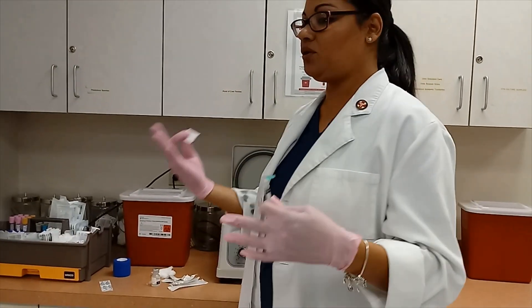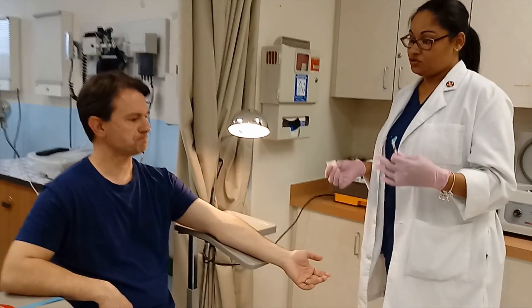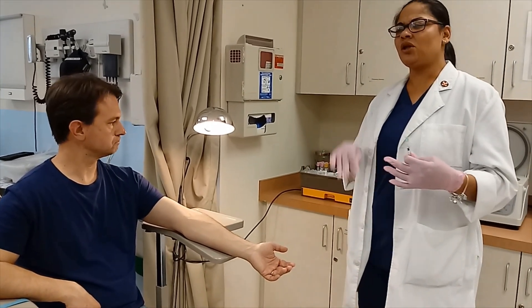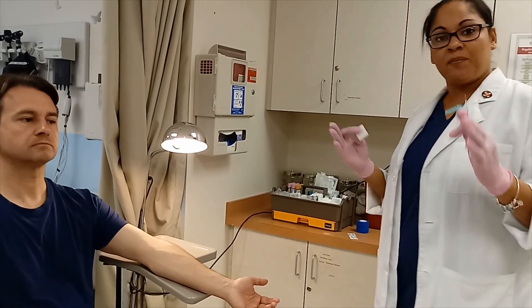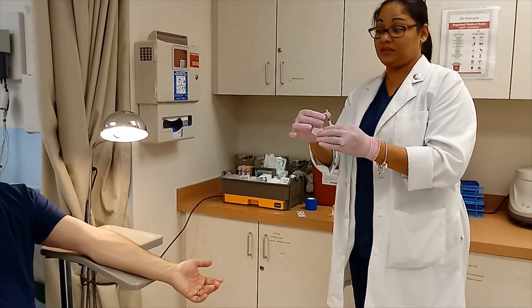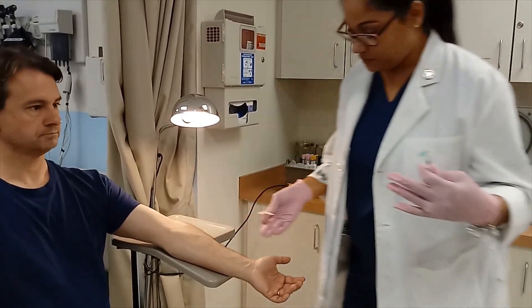We have our patient information and we know allergies. Have you ever had a TB skin test before? — Yes, approximately two years ago. We usually need to do this once a year for TB skin tests, especially people in healthcare. If it's been longer than a year, they do a two-step, meaning they come back a second time within two weeks of the first one. The paperwork the patient brings will tell you if they need a two-step or just a regular TB. If the TB skin test is negative and looks fine, I don't need to bother the physician. But if we see a problem — red mark, any reaction — don't let the patient leave. Get the physician to take a look at it first.